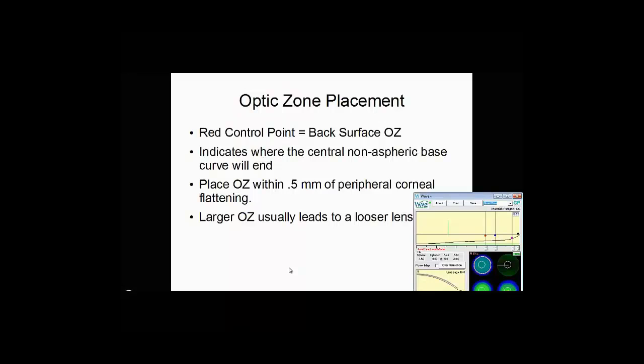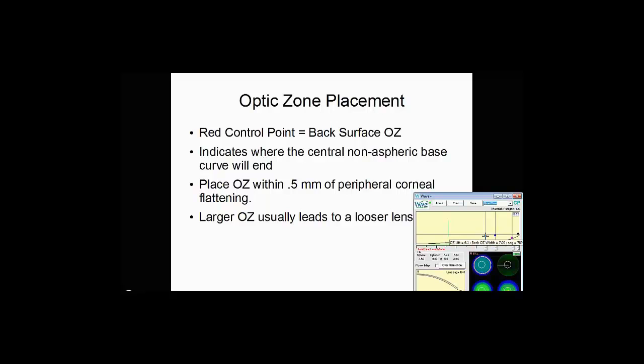The next step is to decide where your optic zone placement will be. The optic zone is controlled by this red control point, and it's the back surface optic zone. It indicates where the central non-aspheric base curve will end. If you're using asphericity, the placement of the optic zone is not as important, but it is still your control point. You want to place the optic zone within about a half millimeter of the peripheral corneal flattening.